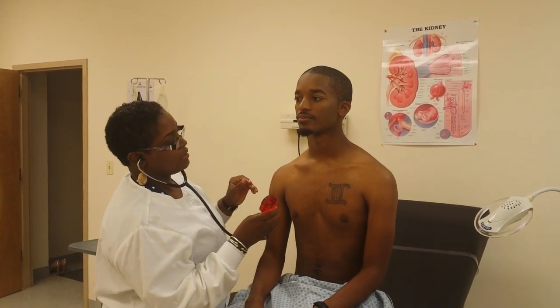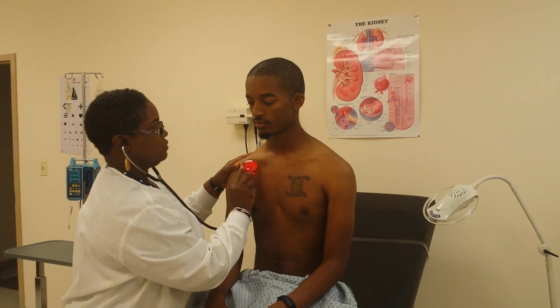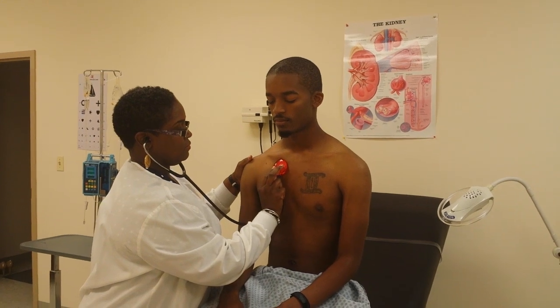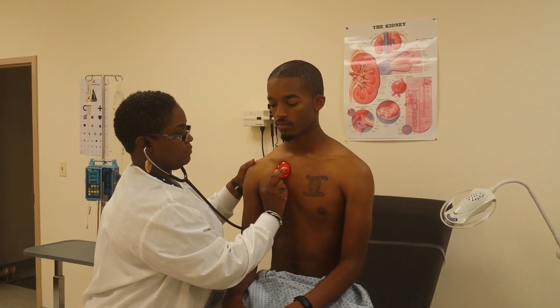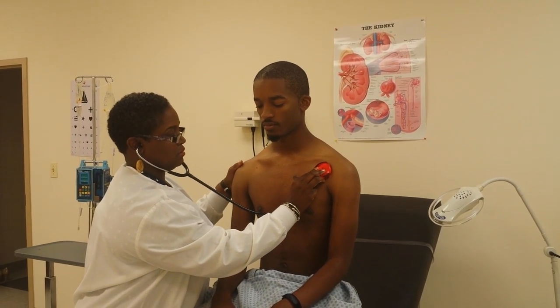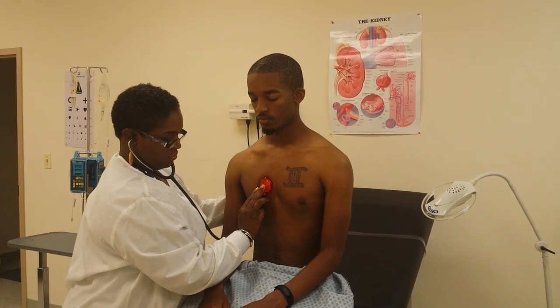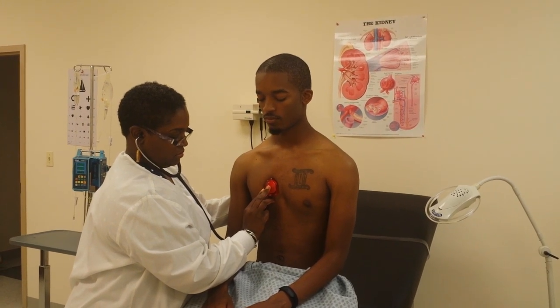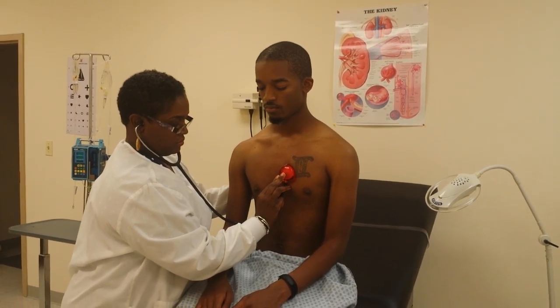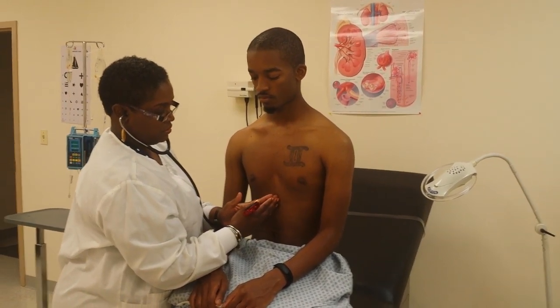Mr. Jones, I'm going to, at this point, continue to listen to your lung sounds. Clavicles are symmetric. We'll begin on your right. Heart sounds are present at this point in the assessment. No murmurs heard. Paying close attention to the mid-clavicular line.